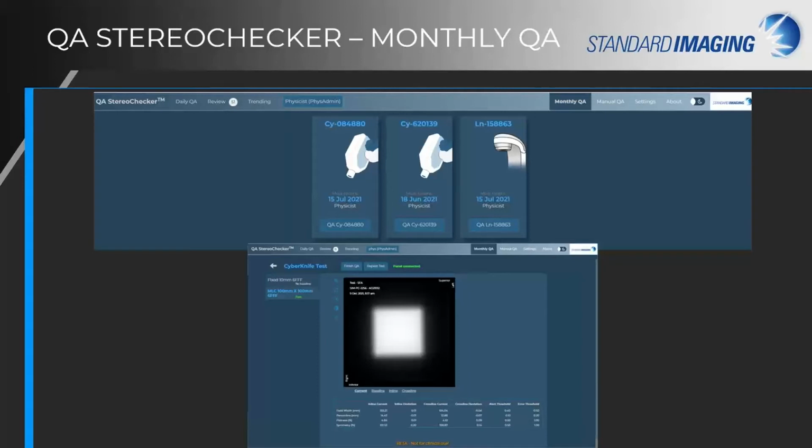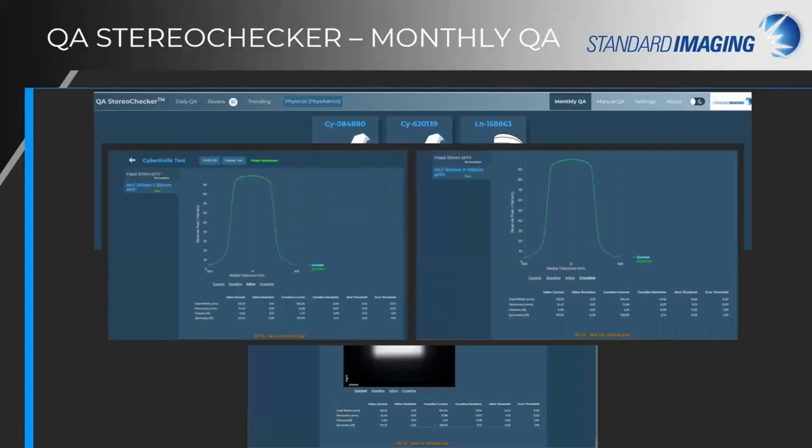Single field analysis for LINAC and CyberKnife QA is reimagined as monthly QA. Like all daily tests, single field images are acquired, analyzed, and results displayed, saved, and trended with the single click of the Start button. Metrics for flatness, symmetry, field width, and penumbra are calculated and trended. Full inline and cross-line profiles are provided.